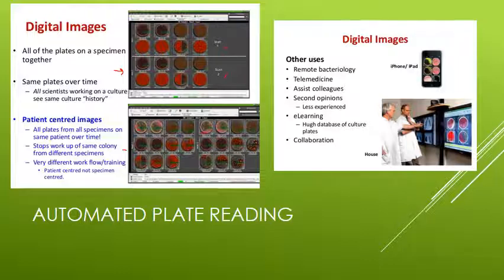If that sputum is on a CF patient and it's the first one of this visit, but at the last visit, 3 months ago, that patient had a serious problem with Pseudomonas aeruginosa, and you see it here on this plate, you can bring it to the doctor's attention. Oh, it's back. That Pseudomonas is here. It doesn't belong here. So it allows you to change the workflow from one specimen at a time kind of thinking to one patient at a time, which hopefully will improve patient outcomes.